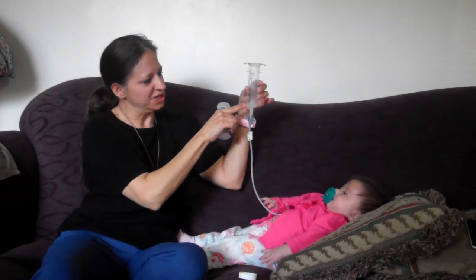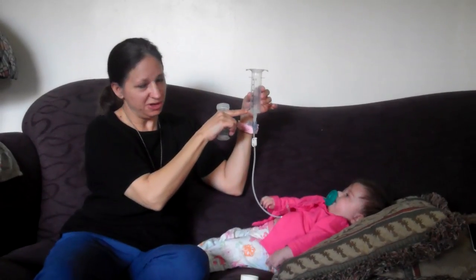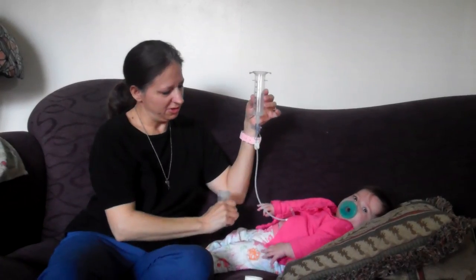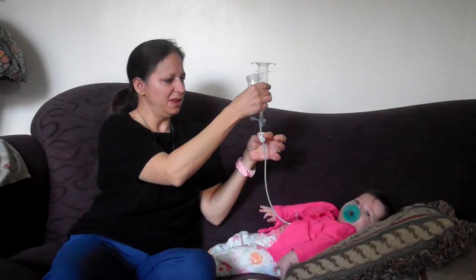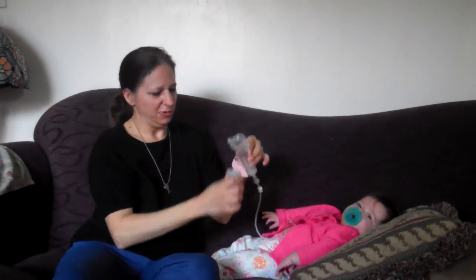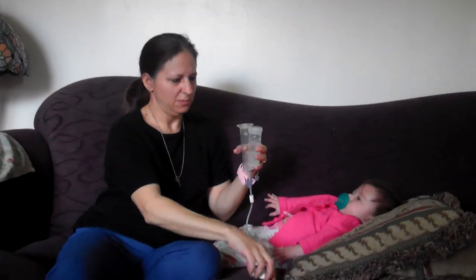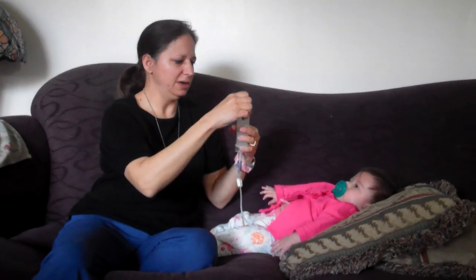Plus you can pay attention up here. As you see this going down, you know it's going down the tube. We don't want to leave any milk residue down there. So now this is clamped. I'm going to pour this back in here so I don't spill it. The lid back on.